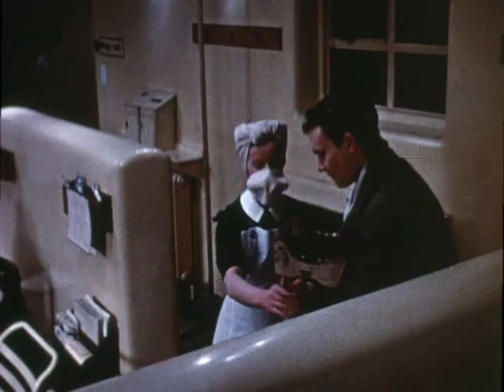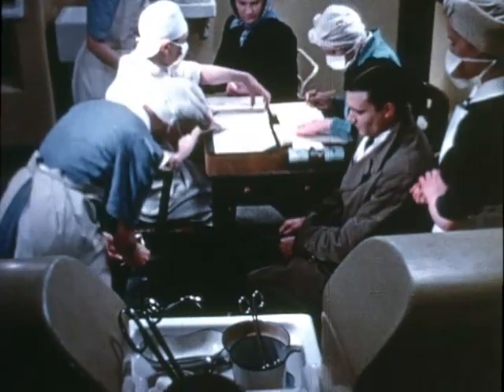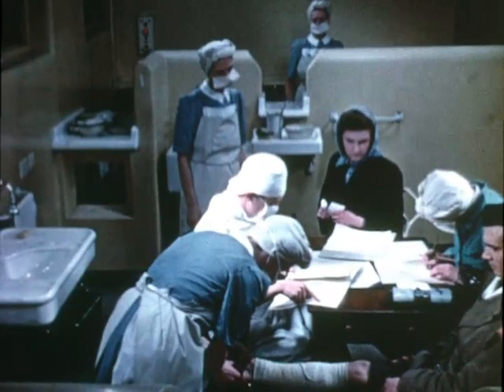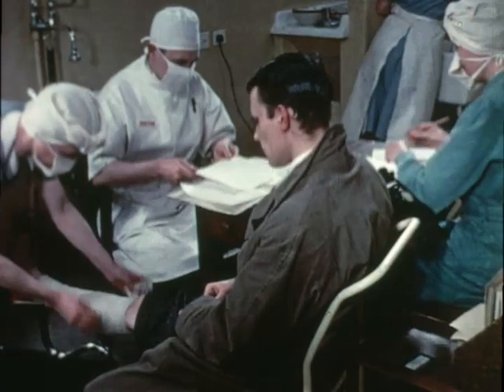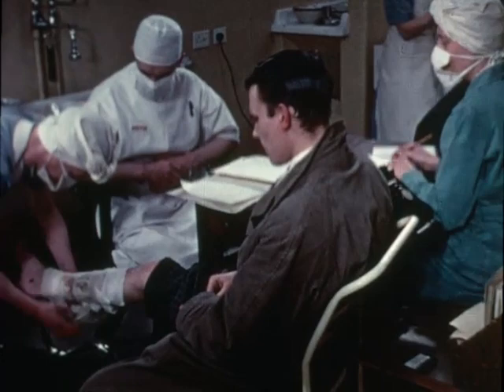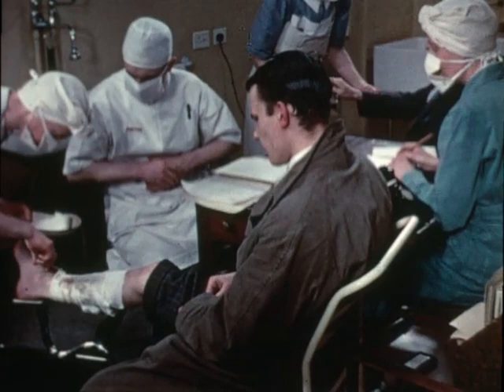The first patient to come in has a superficial burn of the leg. His foot is placed on a stainless steel rest, designed so that its top can be taken off for sterilising. Not all the patients who come to the dressing station have to have their wounds inspected at each visit, so the first thing the doctor does when the patient arrives is to glance at his notes and then tell the nurse whether she should remove the dressings. After the nurse has removed the bandages she follows a careful no-touch technique in removing the inner dressings.